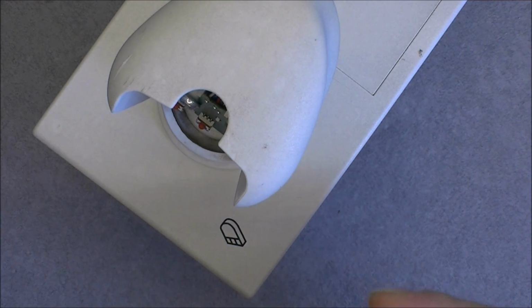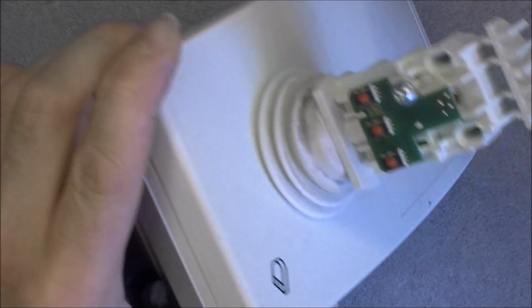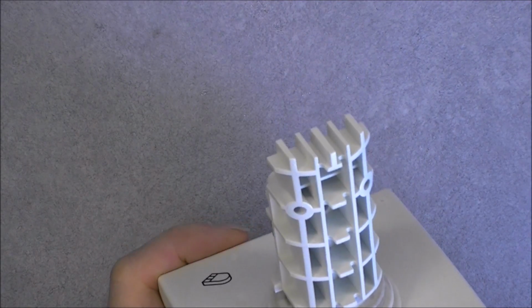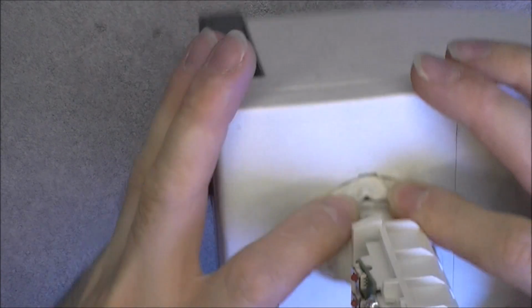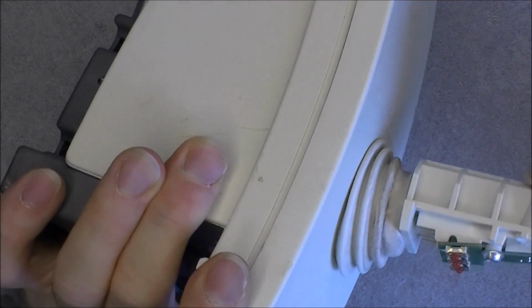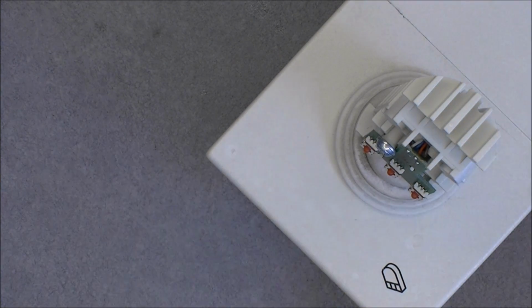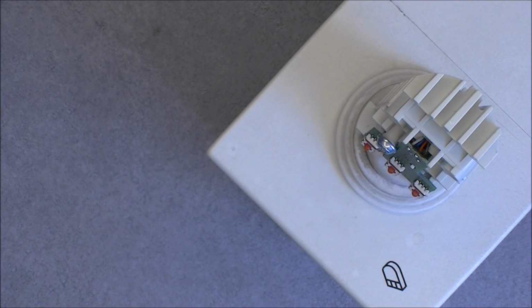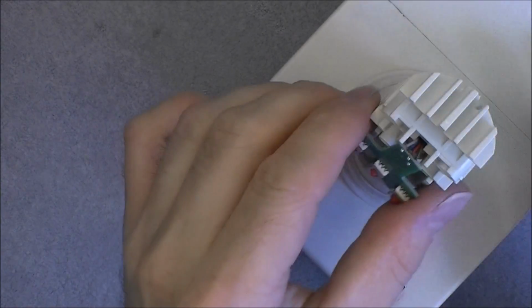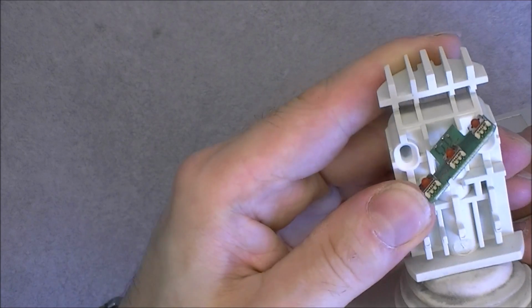Okay, I hope everything will be so easy to take apart. So plastic piece here, and this does just pull out, really nice. Here is what looks like the internal piece, and now I have a feeling I will be able to route it through the hole. Yes, it should be possible. If not, I have to check if I can undo this little circuit board. It is a different size of head. Maybe this one. Yes. So, in fact, I will be annoyed with the wires. Even if I can pull it, the wires will be in the way.